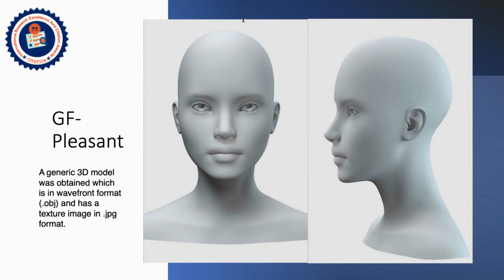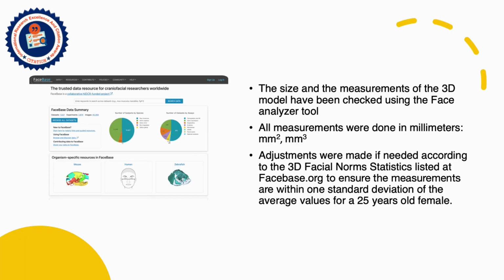So we obtained a model, a generic 3D model, and this was in wavefront format and had a texture image in JPEG format. We did all the measurements on this model utilizing the face analyzer tool that's been developed by our team. All the measurements were done in millimeters, so we got millimeter square, millimeter cube.